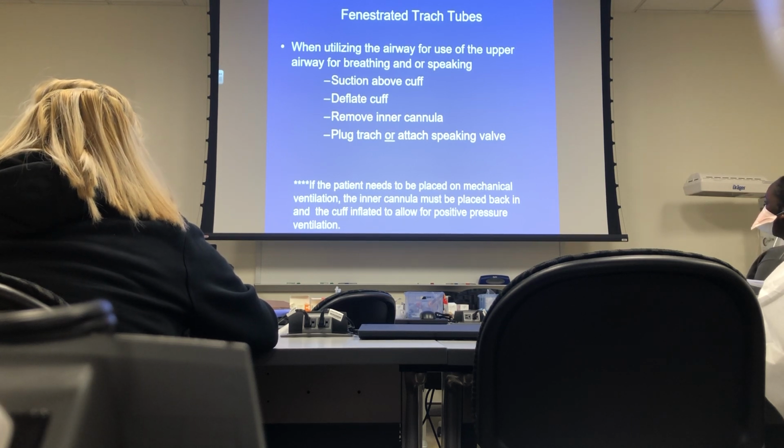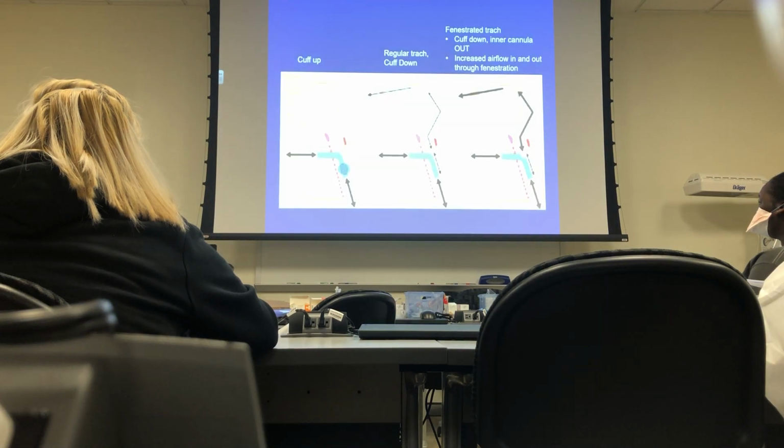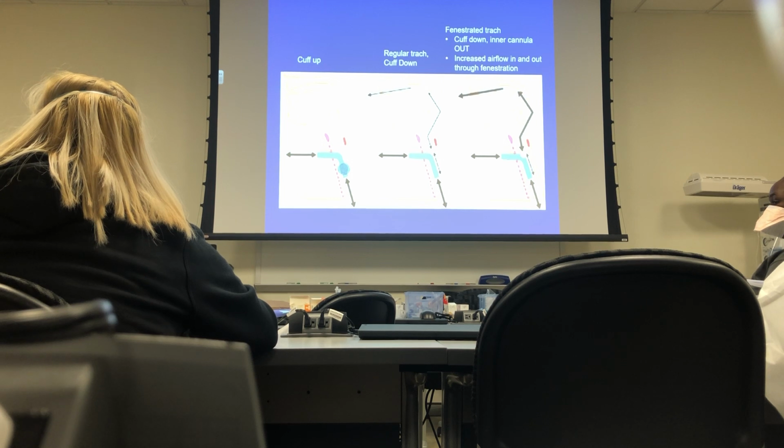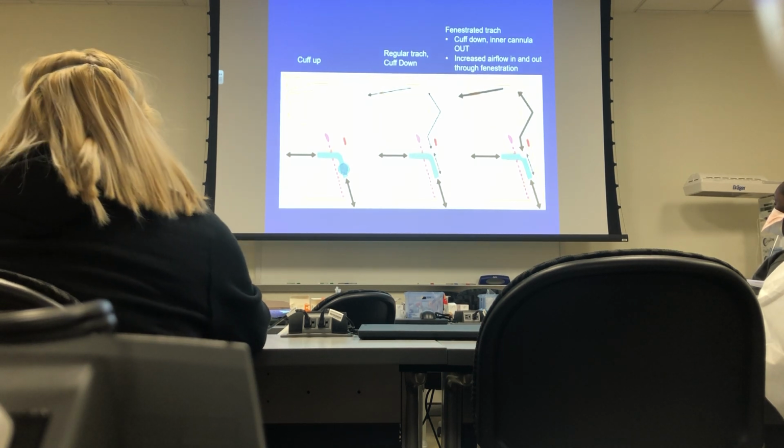Okay. Got it? Okay. Do we have to do suctioning on that? No, not unless they have secretions. Okay. But you definitely have to do it before you drop the cuff, because people have saliva and stuff that drops down there, and as soon as you drop a cuff in somebody, they're coughing, and then there you go, introduce VAPs. Okay? All right, so with the cuff up, air is going in and the inner cannula is in.